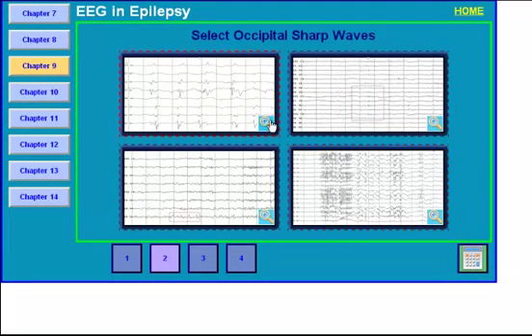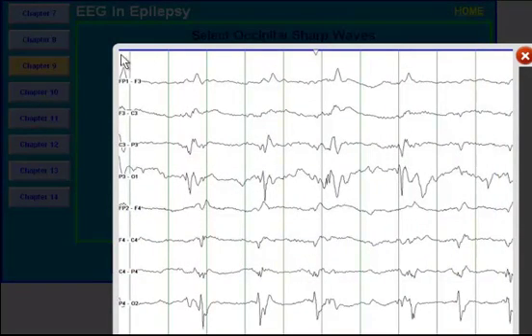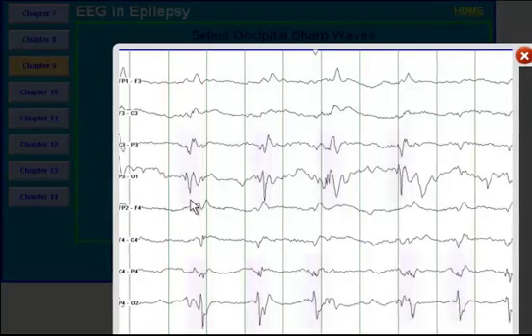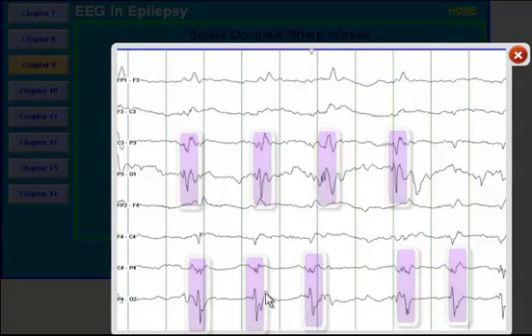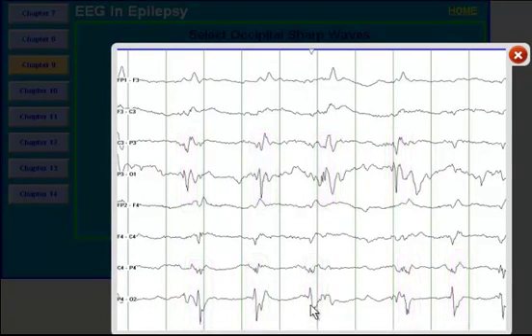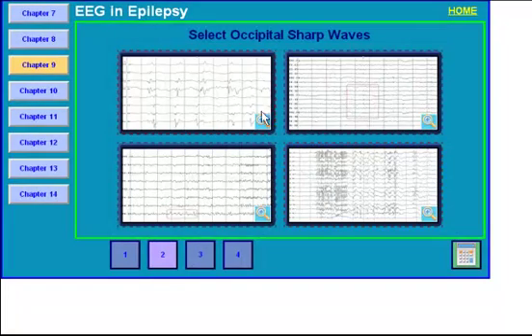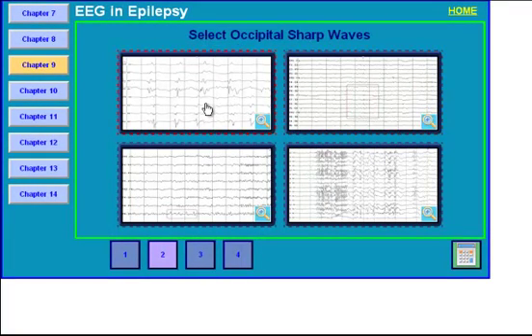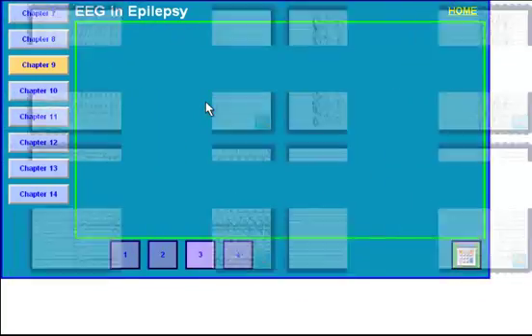And let's move on to this one. What do you see here? This is an EEG which is slow. You are looking at the left hemisphere and the right hemisphere. There are sharp waves with maximal amplitude in the occipital region. So both O1 and O2, you see these sharp waves here. These are occipital sharp waves. This EEG suggests that this person has a high risk of seizure onset from the occipital head regions bilaterally. So the correct answer, select occipital sharp waves. This is the correct answer. And we've gotten it right.